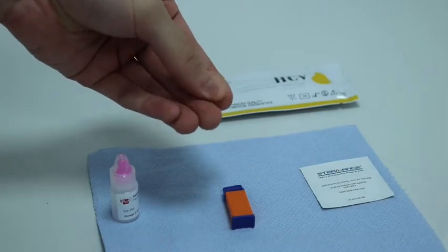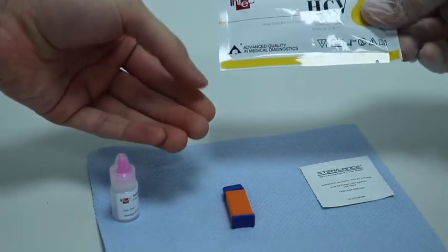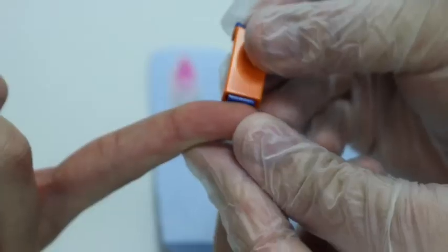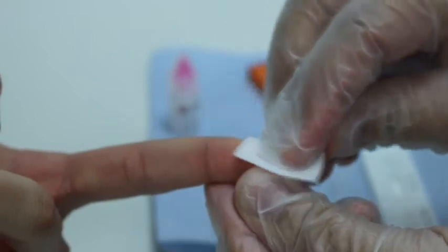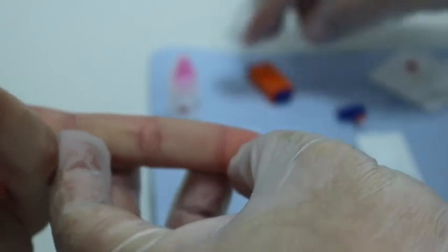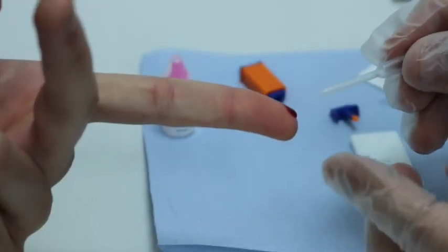In order to ensure the proper amount of sample is collected, ask the patient to sit with their hands pointed to the floor so that the blood may flow to the patient's fingertips. Wipe the finger with the alcohol swab, place the lancet on the side of the finger and press until you hear a click. It does not matter which finger is used for sample collection. Wipe the first drop of blood with the alcohol swab and wait for a blood drop to form on the finger, keeping the finger facing downward and massaging if necessary.